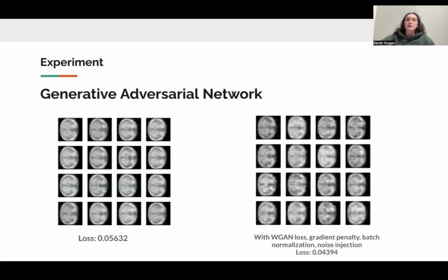One of the main issues we ran into here was mode collapse. So the generator learns to tend toward the same output each time. Basically, this means that it found the simplest possible solution to this problem, which would continuously fool the discriminator, but not create the representation of the data that we're looking for. So as you can see, the results are pretty uniform and again, kind of converging to the same result.